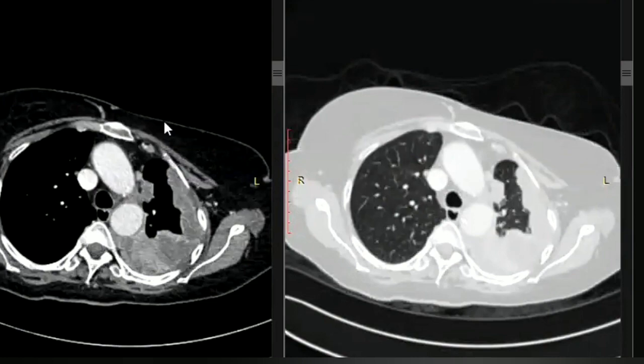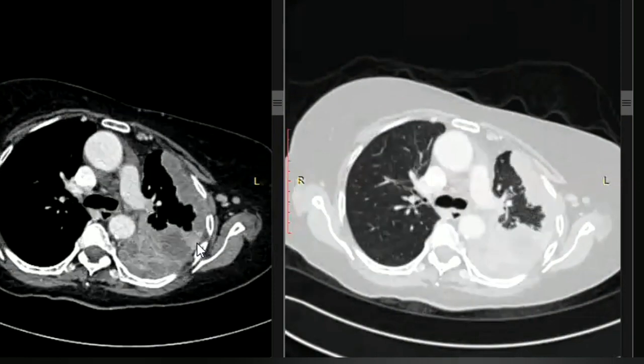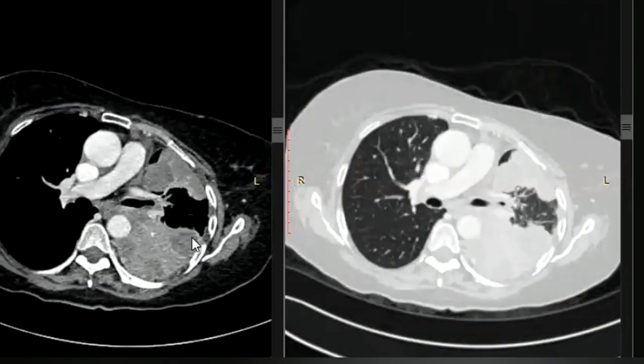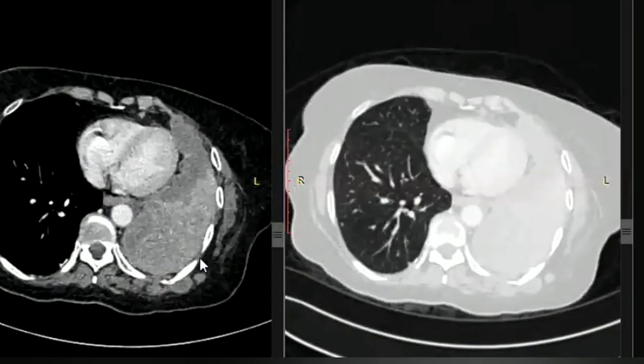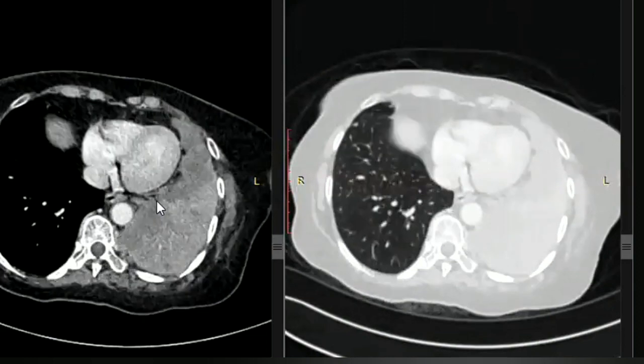Yeah. Okay. Fine. So, what are the characteristic features of mesothelioma on chest X-ray and CT scan? Ma'am, it is basically a solid lesion, and in cases of pleura, it is fixed.